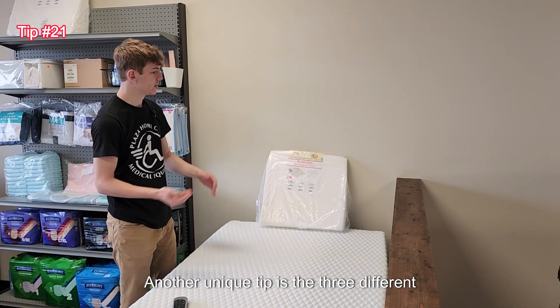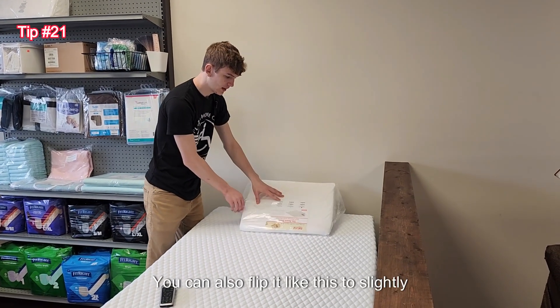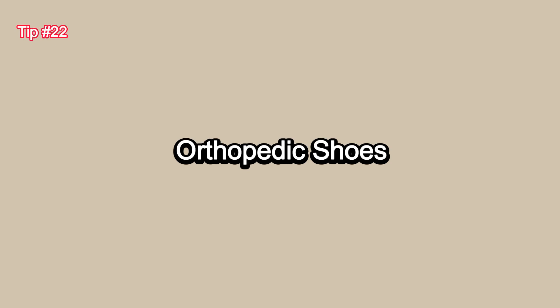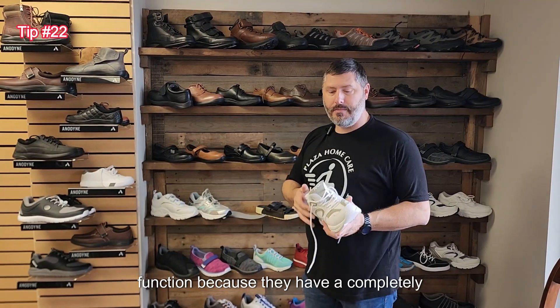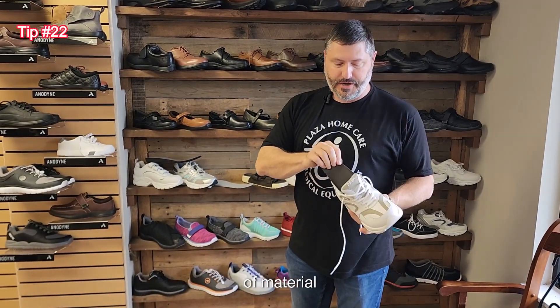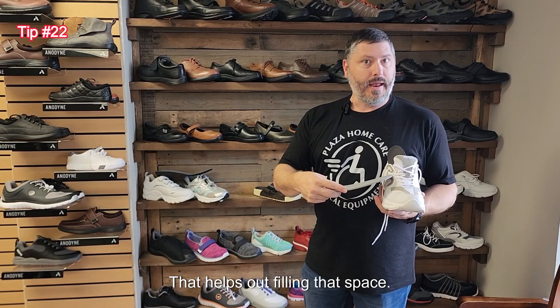Another unique tip is the three different ways you can use a bed wedge. You can see this one in an upright position, you can flip it to slightly elevate the head, or you could use it to elevate your legs. Orthopedic shoes have a very unique function because they have a completely removable footbed and you can take the entire insole out. Beneath that you'll find filler pads — a small piece of material that can vary in thickness to allow you to fill more space within the shoe to accommodate people with a narrow foot.